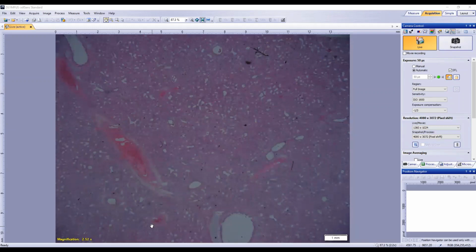Calcification. Potentially calcification, yeah. We'll kind of stick a pin in that because that suggests specific processes, if it's been going on long enough for calcification to happen, or if it's more commonly associated with particular organisms. Yeah, Penny. Now, there's one other thing. I'm just sticking around on the lytic necrosis for a second, then we'll come back to the caseous necrosis.